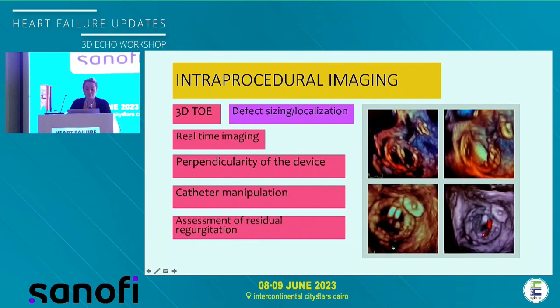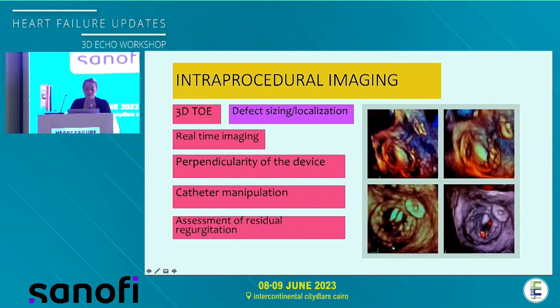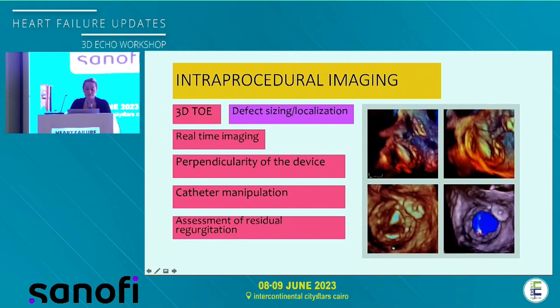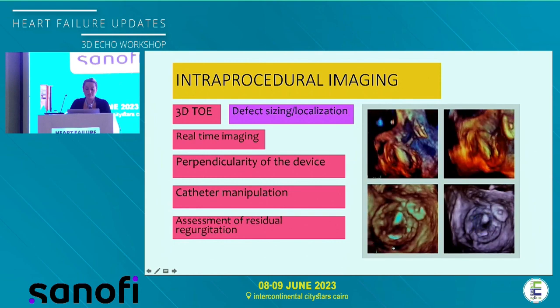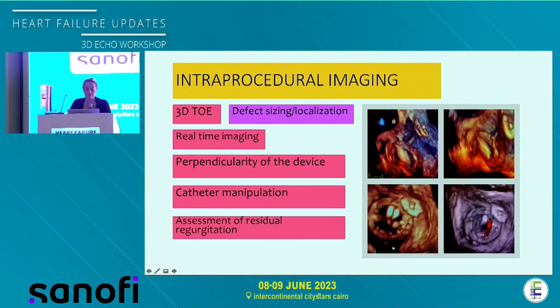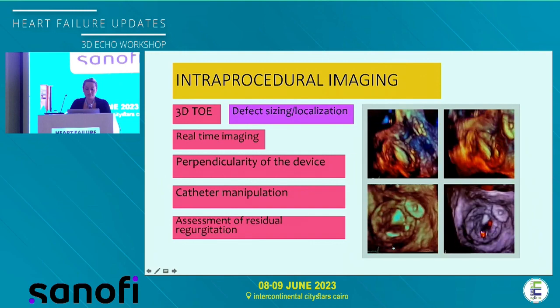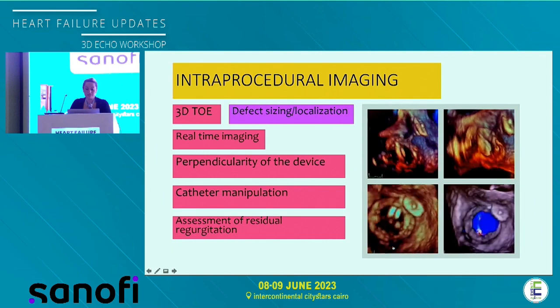It is severe. The patient will definitely have symptoms after the procedure, and you have to do something with that. But if you have a native mild to moderate aortic regurgitation at the beginning, and you have mild to moderate regurgitation after the procedure, the patient can tolerate it. But vice versa, it's difficult.